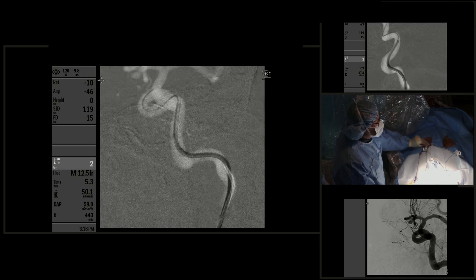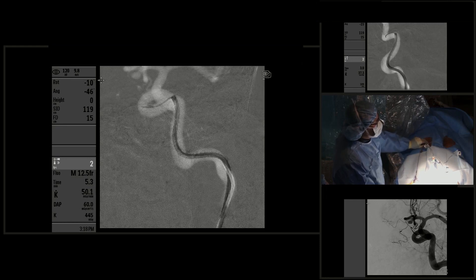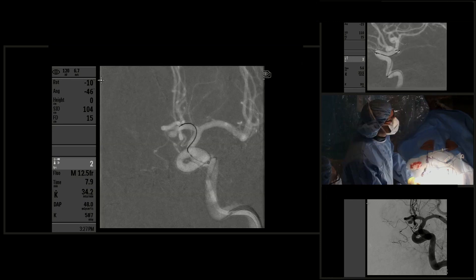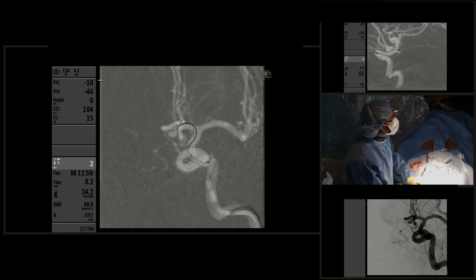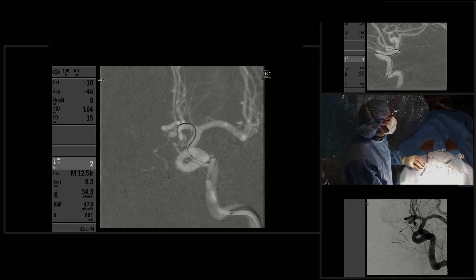In order to embolize safely, we need to get access to the aneurysm. We used for support not just a guide catheter that we advanced to the distal cervical segment of the left internal carotid artery, but also an intermediate catheter. In this specific case, it was a DAC 038 catheter, 125 centimeters, that we advanced to the petrous cavernous segment of the left internal carotid artery.